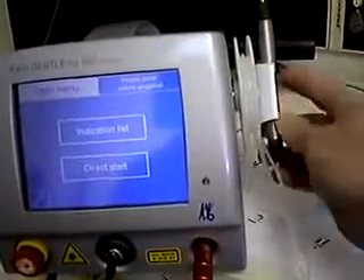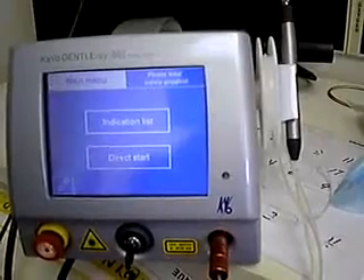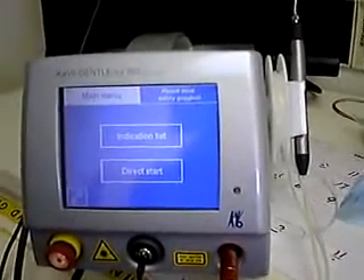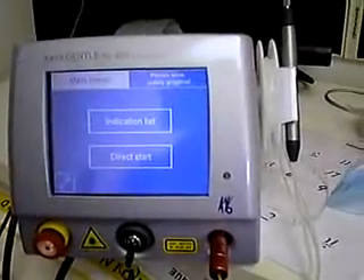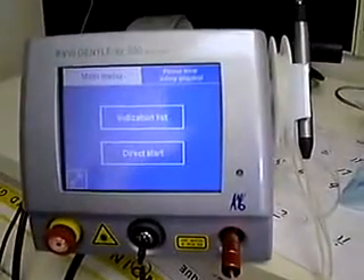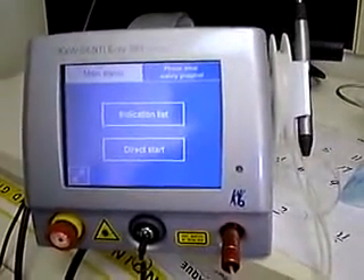Overall, I like the feel of it — it feels like a very well-made unit. It has worked fine in my hands in this office, the handpiece is weighted very nicely, and I think it's a very, very nice laser. If you're in the market for a diode laser, you may want to consider the KaVo Gentleray 980.